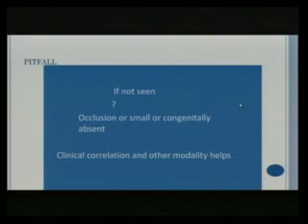So when you don't see a vertebral artery on Doppler, don't stop there. Don't just say it's either absent, atretic, or congenitally diminutive, or whatever. You must work that up with a second modality. I always order a CT angiography just to be sure. What if there is a vertebral artery dissection? What if there's a thrombosis? What if there's a stenosis? All these three will be seen under the umbrella of non-visualization sonographically.